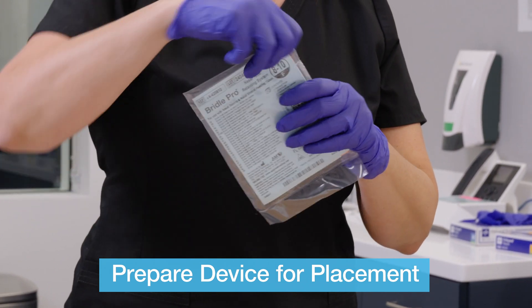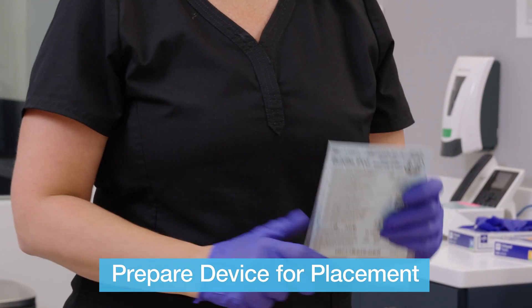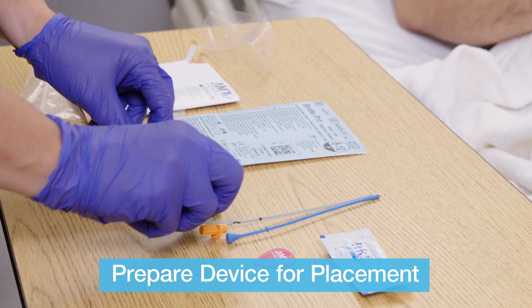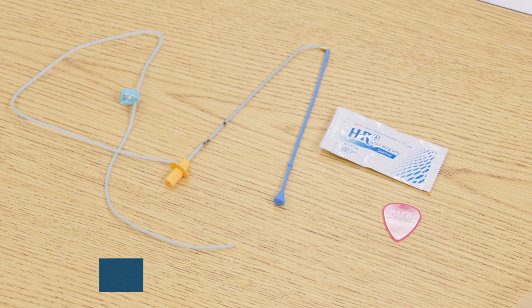Begin by opening the product packaging. It is important to note the packaging indicates the French size. With the package now open, you can lubricate the probe and tubing of the AMT Bridal Pro.